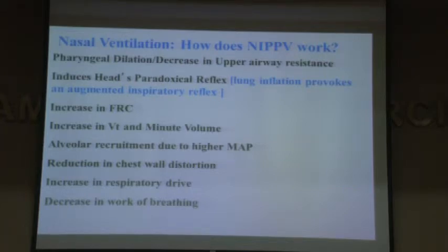Tidal volume increases, because you are using a much higher delta pressure. Recruitment is better, and there is reduction in chest wall distortion and work of breathing. Plus, most important, you still have all the benefits of nasal CPAP, in addition to the other benefits I just listed for NIPPV.